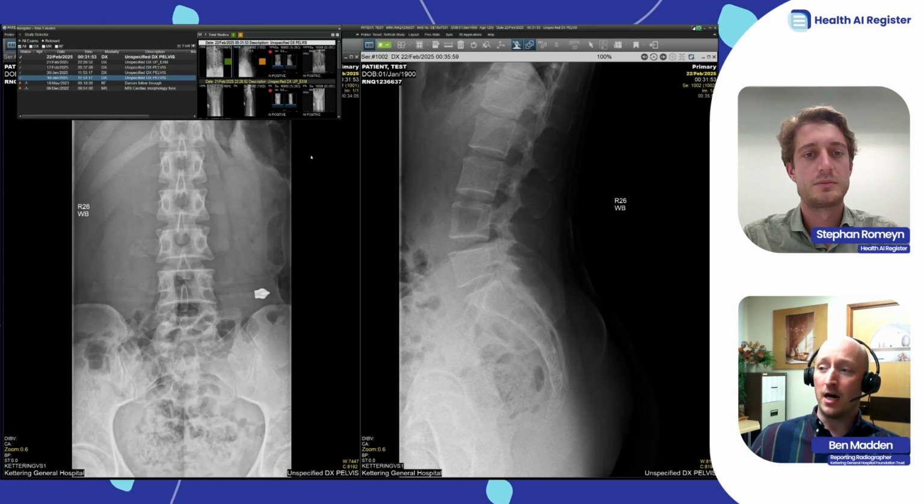So in a lot of the cases, especially at night, they will be managing the patient based on their clinical opinion and also RB's opinion. And they do also have access to this RB output? Yes, they do. They have the secondary capture as well, so they can act on that straight away. But during the day, if there's any query between RB and their opinion, they call us and we then give the official report.